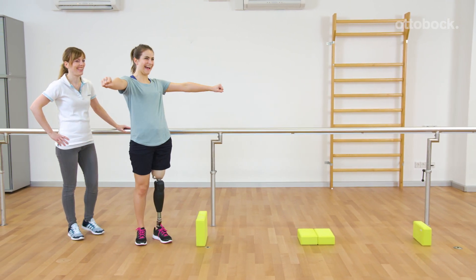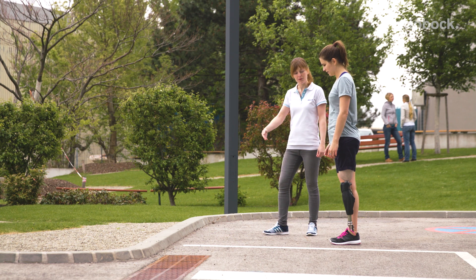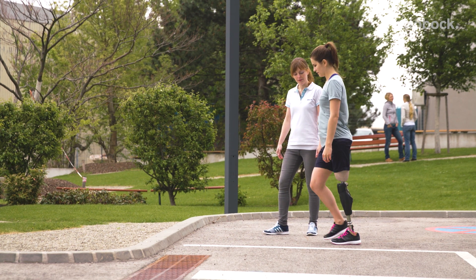Integrate the stairs and obstacle function outdoors for training to maximally benefit in everyday life situations.